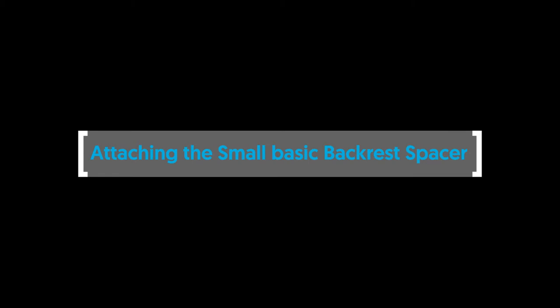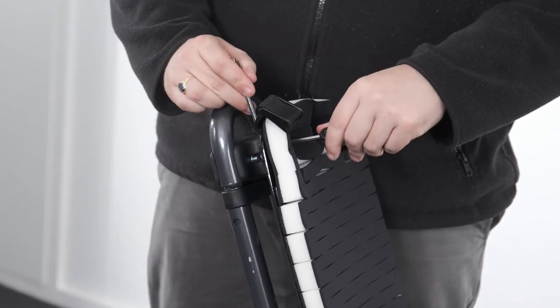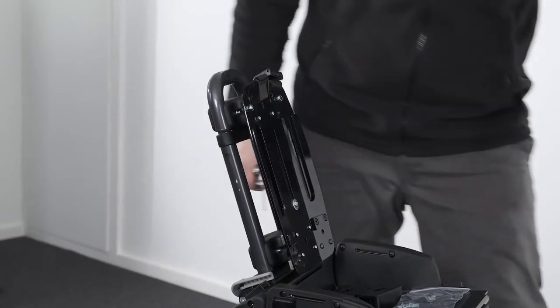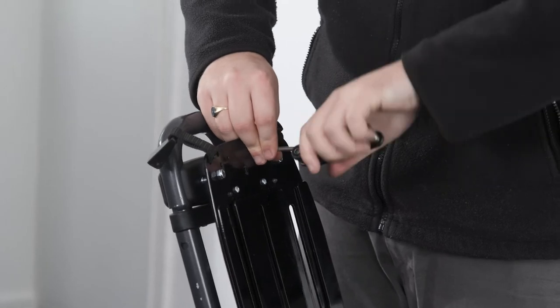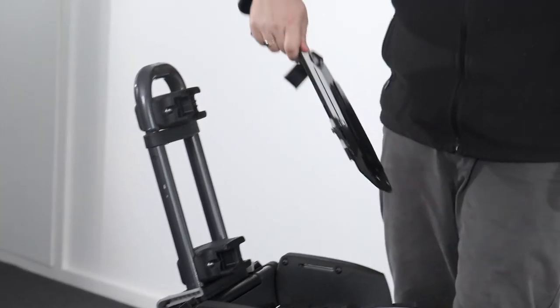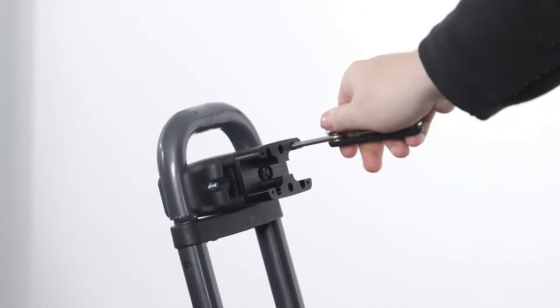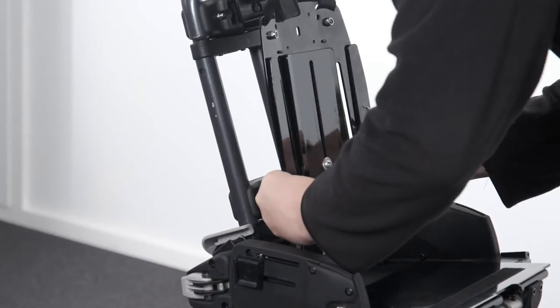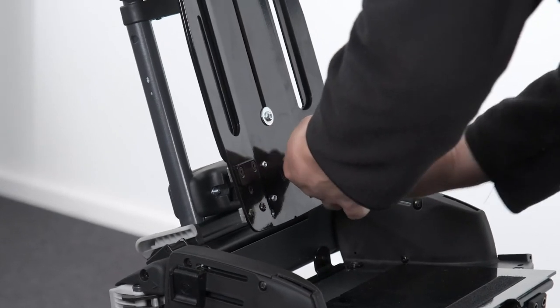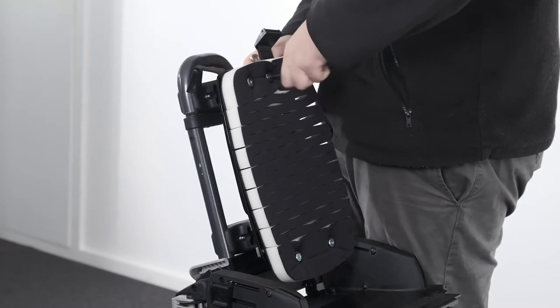Attaching the small basic backrest spacer. To attach the small basic backrest spacer, remove the cushion cover from the backrest and remove the four screws, top and bottom, to separate the backrest platework from the clamps. Secure the spacers using the four longer screws onto the top and bottom clamps. Place the backplate spacer onto the front surface of the lower clamp moulding. Reattach the backrest platework by securing the four screws, top and bottom. Attach the cushion foam and secure using the four screws and a 10mm spanner.